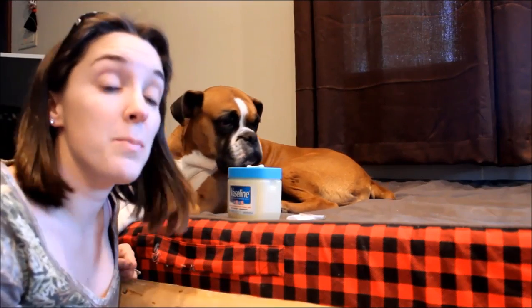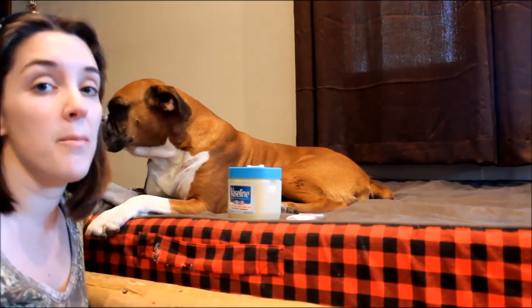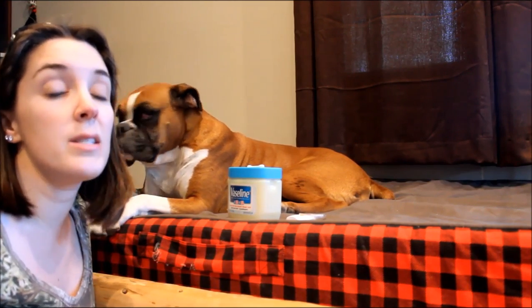Hey guys, welcome to Top Dog Tips. My name is Samantha and today I want to talk to you about how to take a dog's temperature. This is something that I'm frequently asked. If you've taken your dog to the vet and they've had their temperature taken there, then you may already know that this is most accurately done rectally.